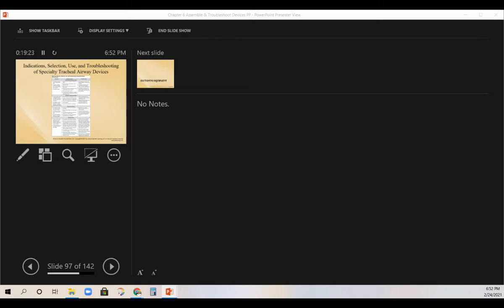Some buttons provide an adapter for positive pressure ventilation in case they get a mucus plug and have to go back on ventilation or something else happens. Regularly pass the suction catheter through a button to ensure patency. So if you have to, you're going to troubleshoot it that way. If respiratory distress occurs, the tube may be protruding too far into the trachea, so you might want to reposition it and change the number of spacers.